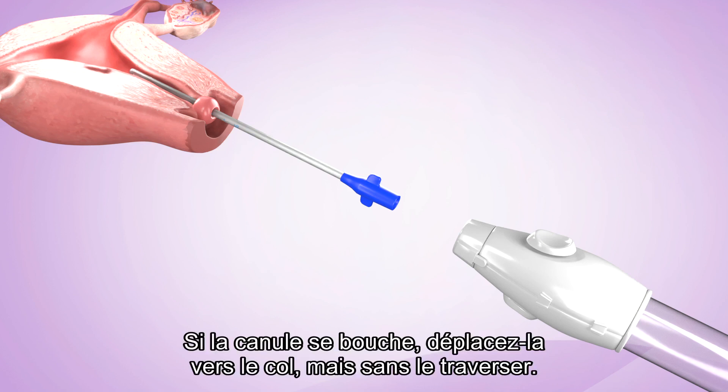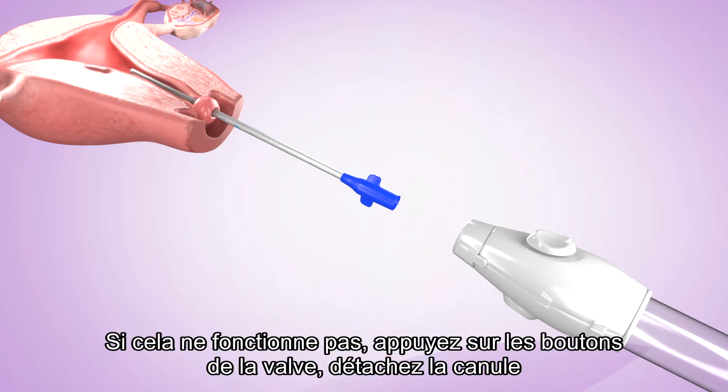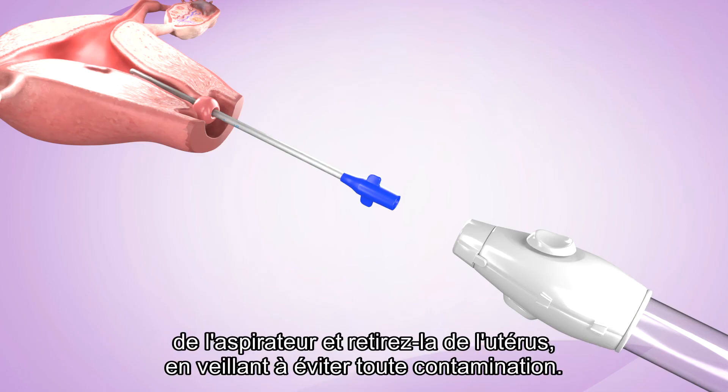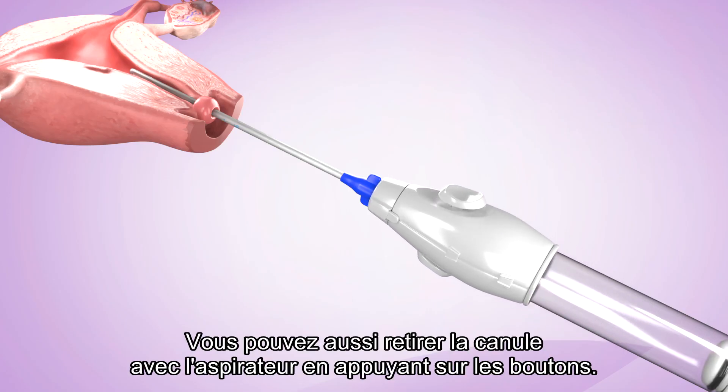If the cannula becomes clogged, move it toward the cervical os but not through it. This movement will often unclog the cannula. If this does not work, depress the valve buttons and disconnect the cannula from the aspirator and remove it from the uterus, taking care to prevent contamination. Alternatively, withdraw the cannula and aspirator together by depressing the buttons.